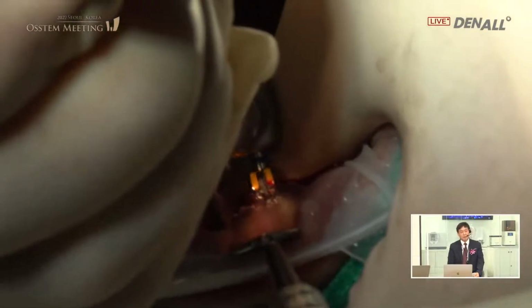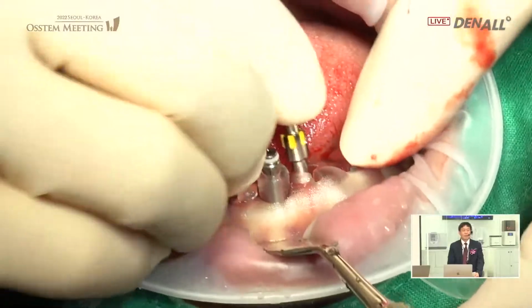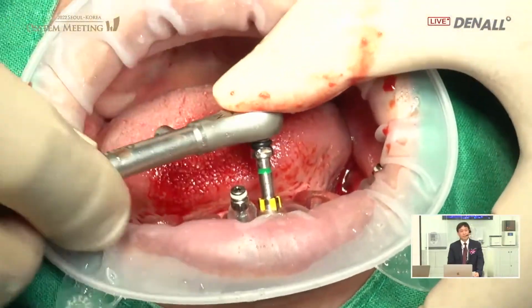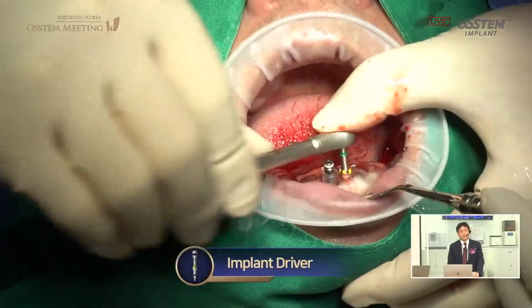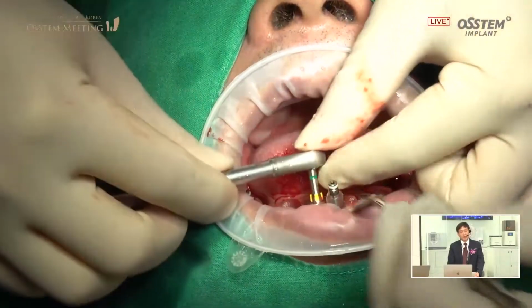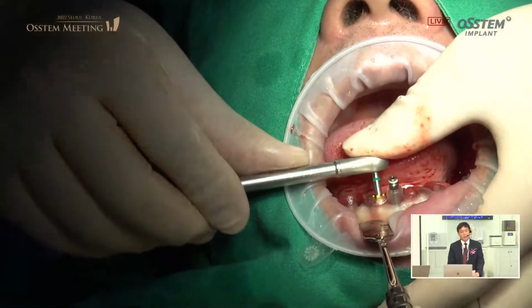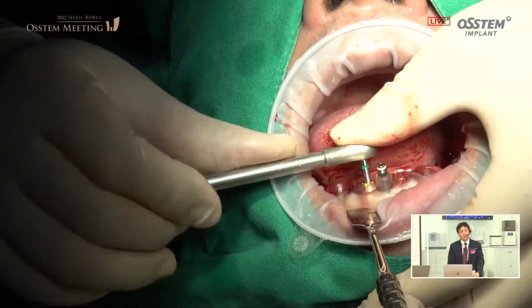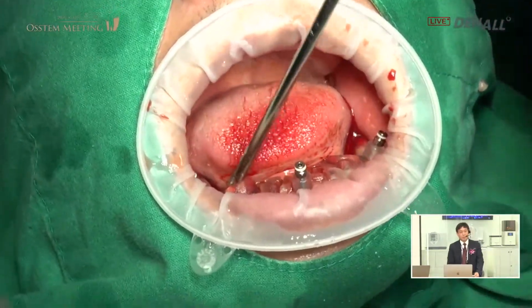In number 32, the implant is being placed. It's being placed approximately 80%, and the fixture driver is used to place it 100%. It's lower anterior number 32 and number 42, adjusted up to the final depth. You need to pay attention to aligning the yellow line.